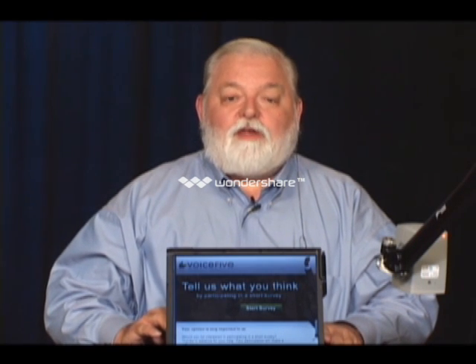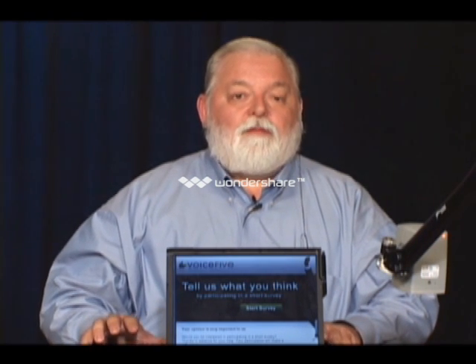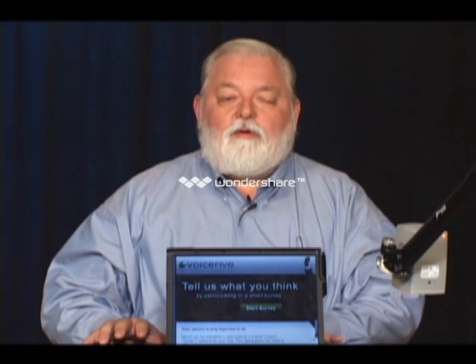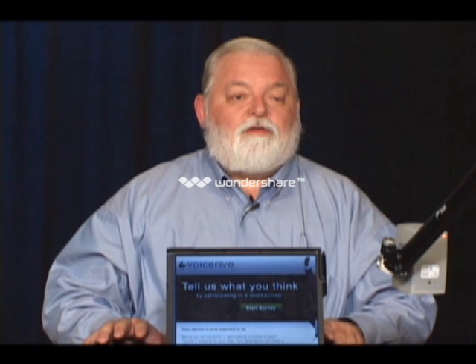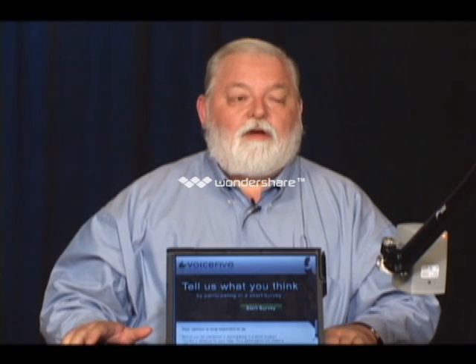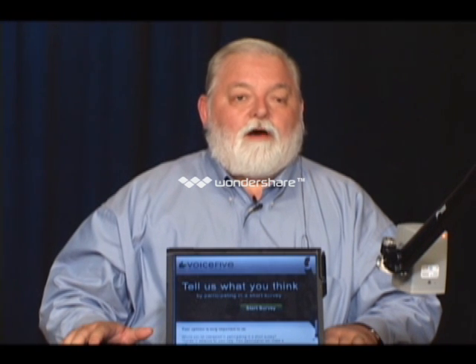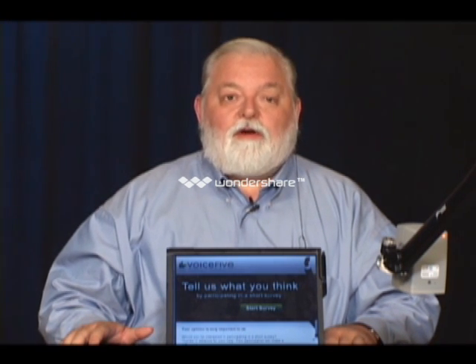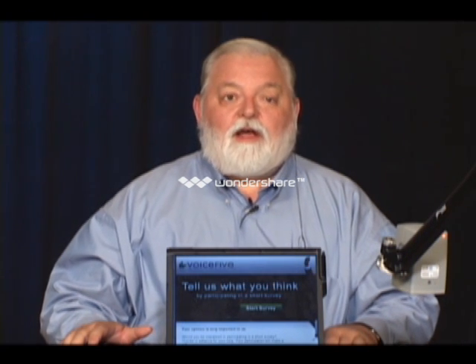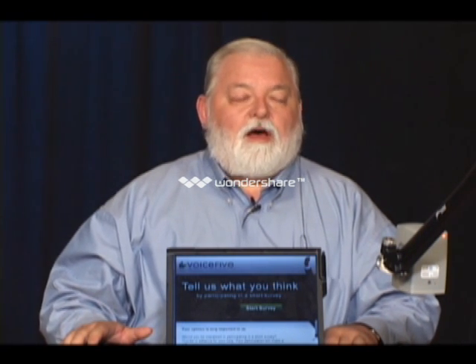Okay, there's a couple of ways. If you're running Magic and JAWS together, then as I arrow around the screen or tab around the screen or whatever I need to do to move from one place to the other, you will see on the screen exactly where JAWS is looking, because Magic will be there and it will actually highlight with a little green outline of where it is.